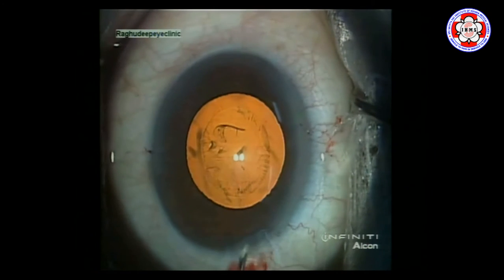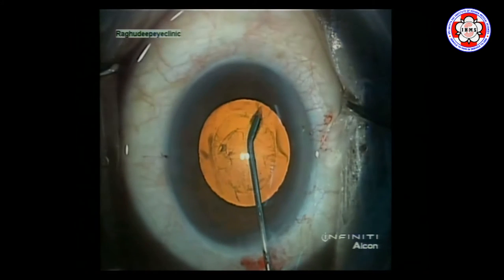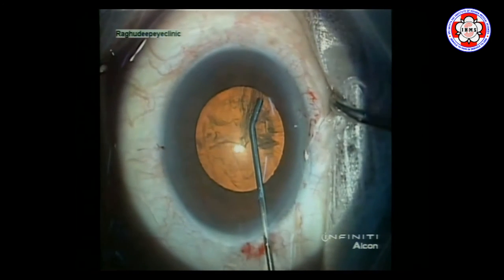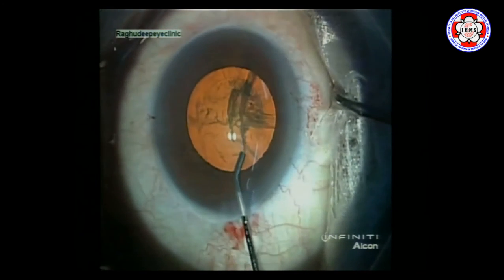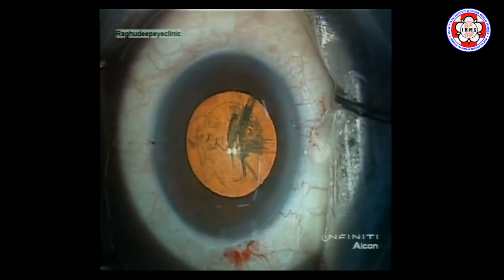Today's modification is essentially the same except we use our own modification of an Akahoshi cannula — a small vent cannula. Unlike a routine cannula, we go inside the anterior capsule without tenting it, going a little deeper, angling towards the equator of the lens, then inject a short burst of fluid. Once you see the wave of fluid passing, you can enhance it. You don't have to over-hydrate — one wave of fluid should be enough.